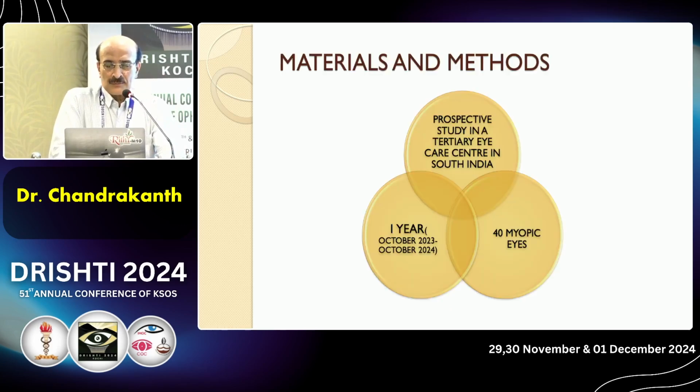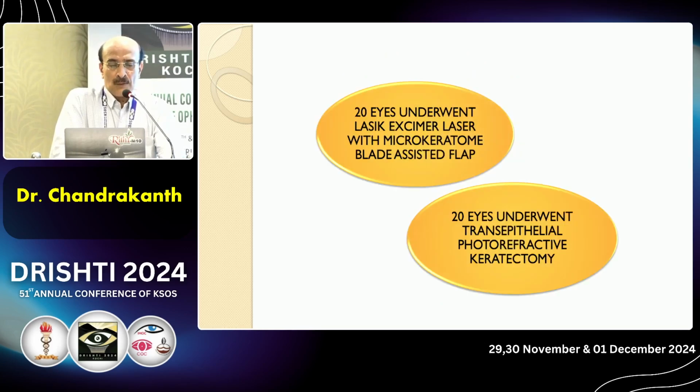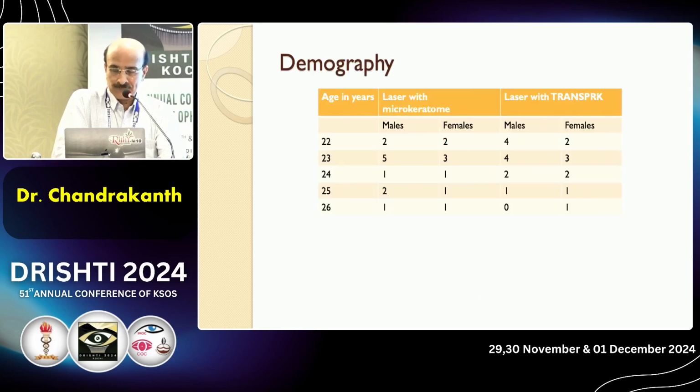Materials and methods: it's a prospective study in a tertiary eye care center in South India. 1 year follow-up, 40 myopic eyes, 20 in each group. 20 eyes underwent Lasik Excimer laser with microkeratome blade assisted flap. 20 eyes underwent transepithelial photorefractive keratectomy.